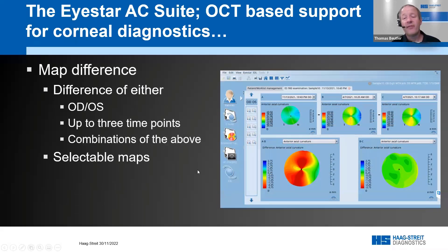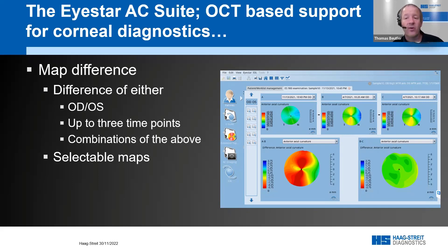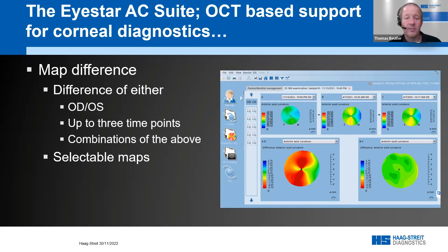You can also do the same comparison with just maps for a larger representation of the difference, and compare up to three different data sets — for example, three time points of the same patient. We see the difference map of A minus B and B minus C, selectable from the pull-down menu. This is an easy, intuitive tool to show progression in axial curvature or any other parameter available as a map.